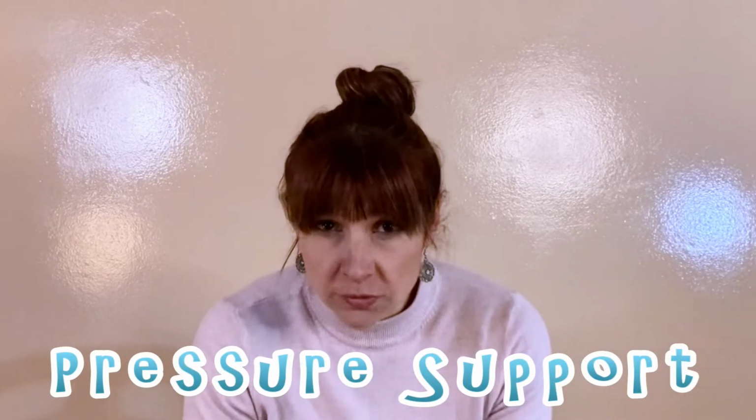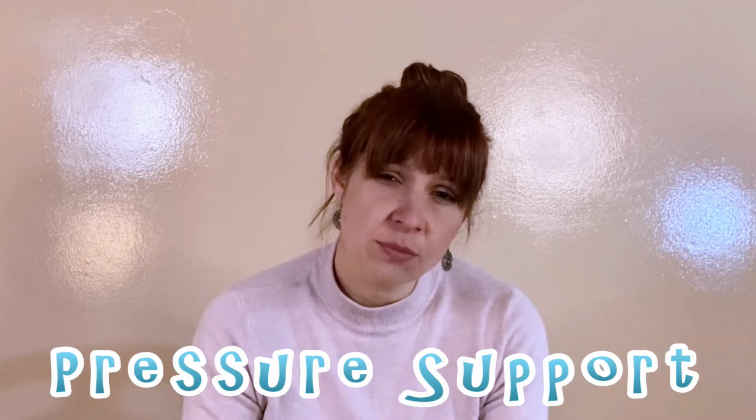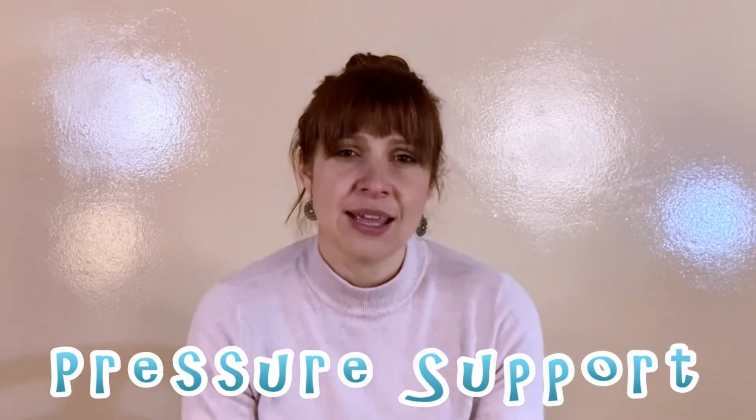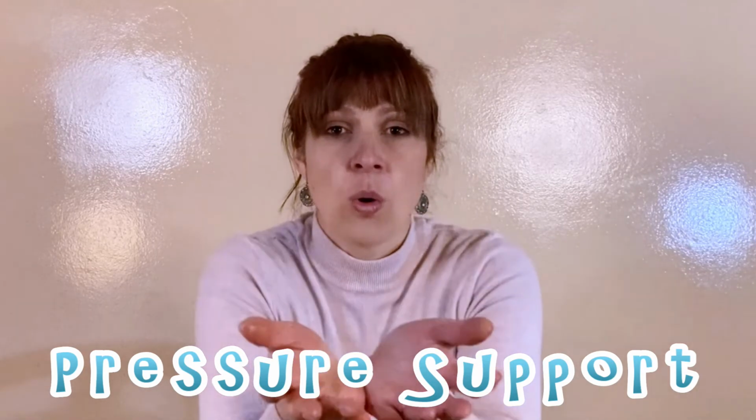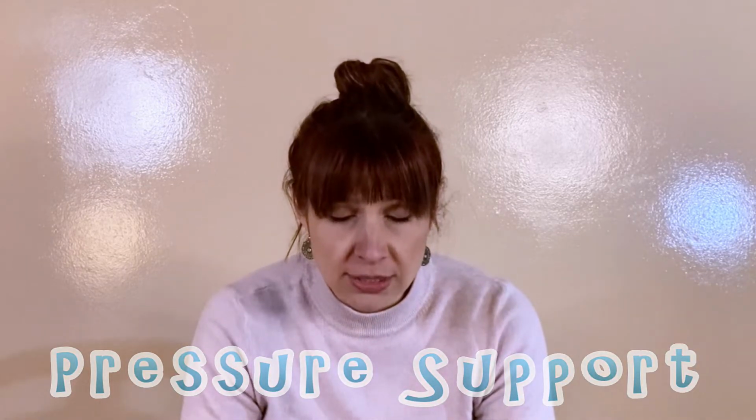And all it involves is the patient triggers a breath. And I say, hey, here's a little bit of extra. Here's a gift for you. There's some pressure for you. So the patient triggers, the machine goes, oh, let me help. There's your big breath. It's a patient-initiated breath. The patient is in control of his own breath. The machine's not going to give him extra help if he doesn't ask for it. And it is just a supported breath. That's why we call it pressure support.